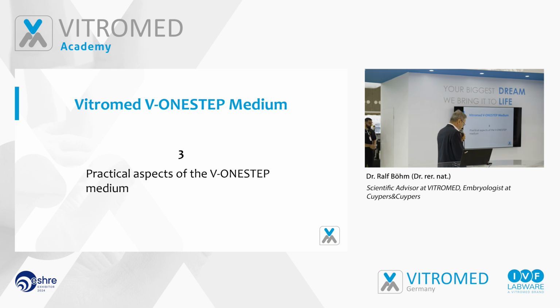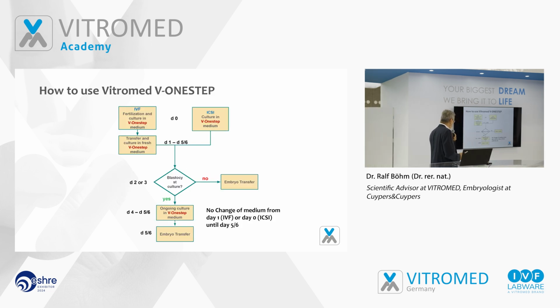Some practical aspects. Here's just the way to use it. For IVF, bring together the cells, it means the oocytes and the sperms. And on day 0 and day 1, you, of course, have to remove the cumulus cells, and then you put them in the same medium.